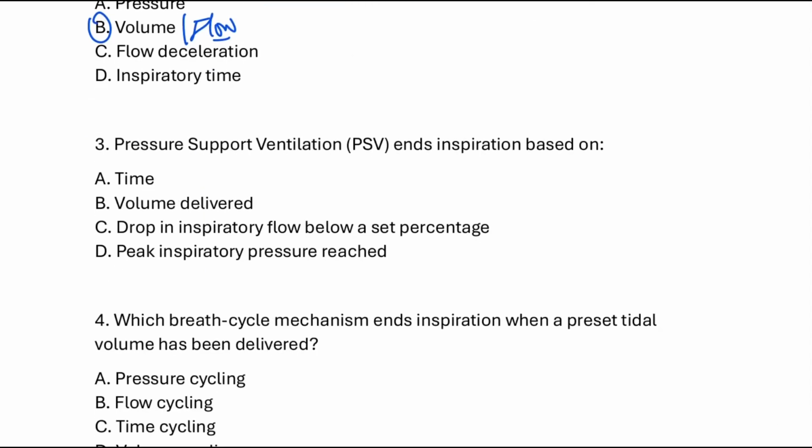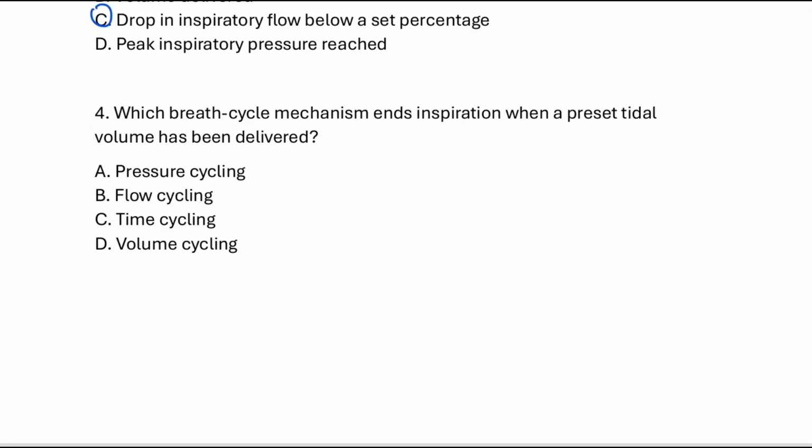Pressure support ventilation ends inspiration based on, what do you guys think? Very good. Remember, we said that it is a drop in inspiratory flow below a set percentage. That's when the breath is going to stop. And then moving on to the last question.